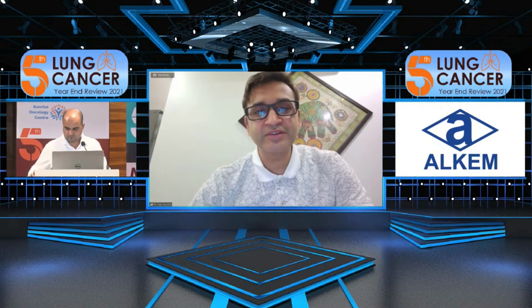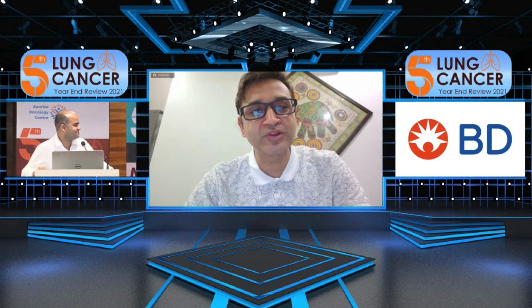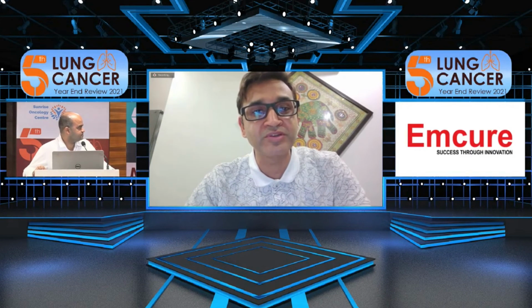Yes. But recently, some data has shown that as compared to RT-PCR, NGS is now being recommended, especially for exon 20 mutation detection, because there's data where Foundation One NGS was compared with the conventional RT-PCR, and around 40% of the mutations on exon 20 were missed by the conventional RT-PCR.